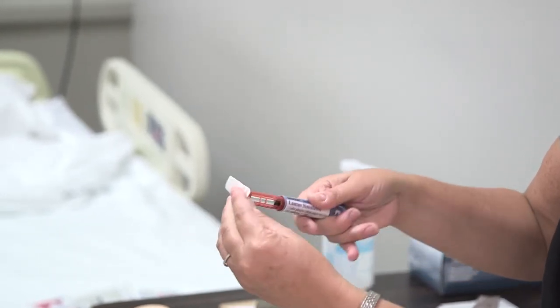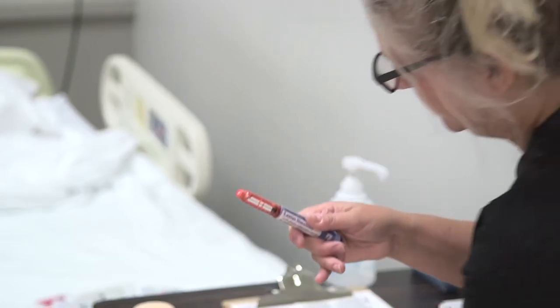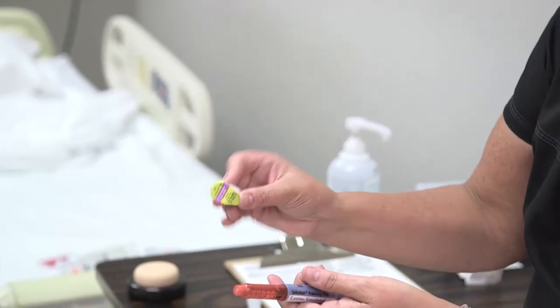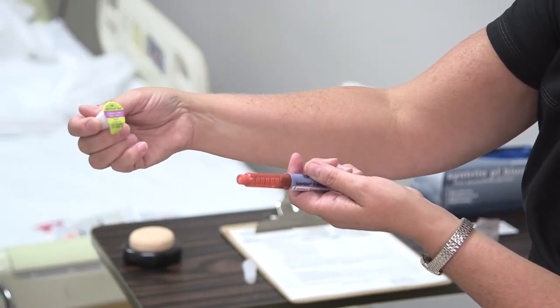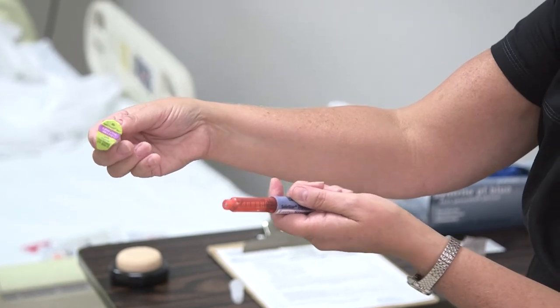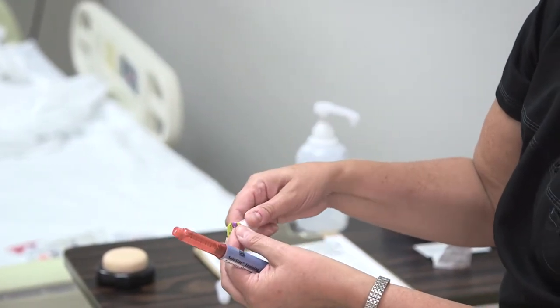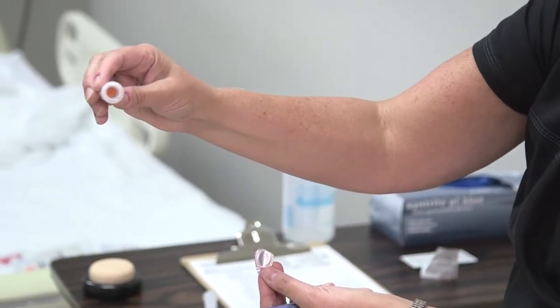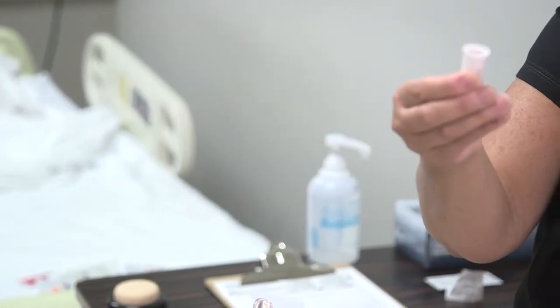Let that dry. There are various needles available — this one is very common. It's a 30 gauge, 5/16 needle, so it's very small. You won't normally see these used on regular syringes; they are specific to insulin pens.